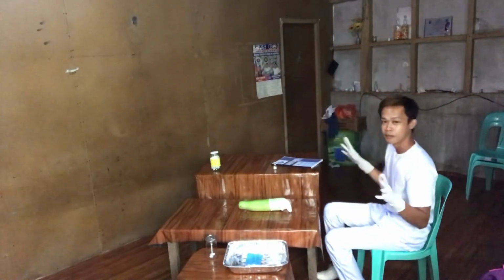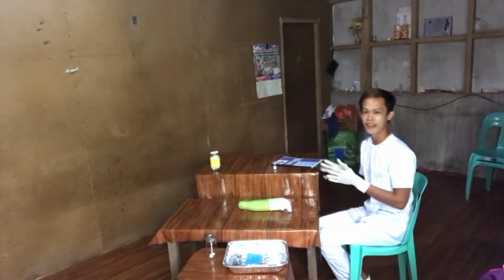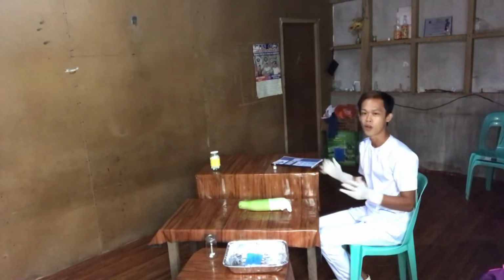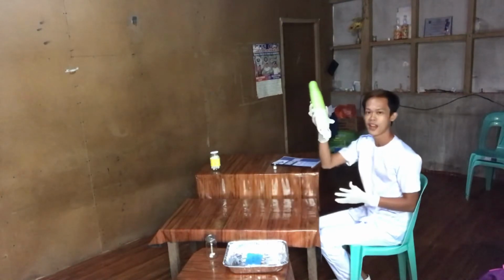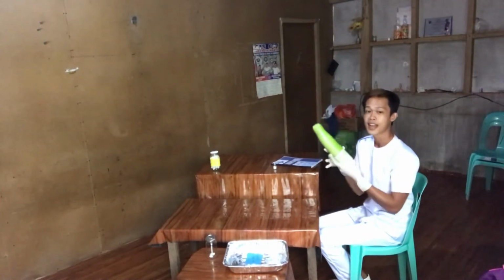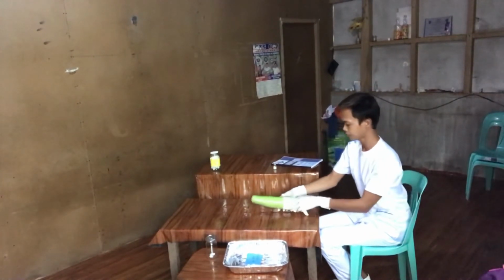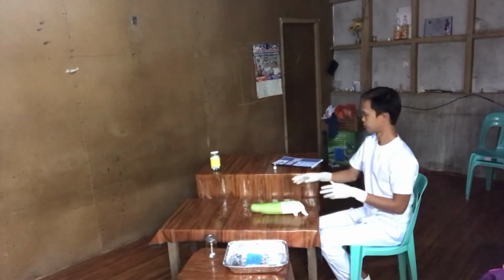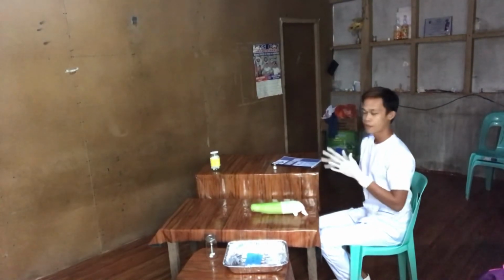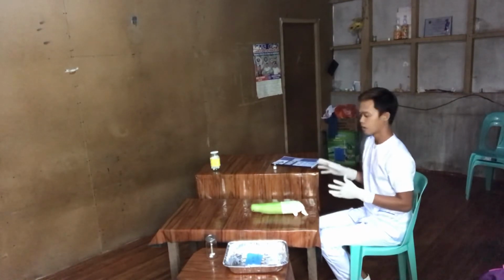Now we're going to perform injecting the medicine via the intramuscular site, and we're going to use green vegetables for administering the medicine. Let's assume that this is an intramuscular site of the patient. The first thing we're going to do is check the medication order in the patient chart.